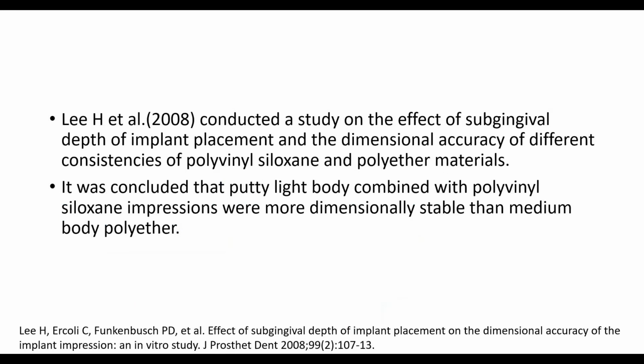Next study by Lee et al. was conducted to check the effect of subgingival depth of implant placement and the dimensional accuracy of different consistencies of PVS and polyether material. In this study, they concluded that putty light body combined with polyvinyl siloxane impression was more dimensionally stable when compared to that of medium body polyether impression material.